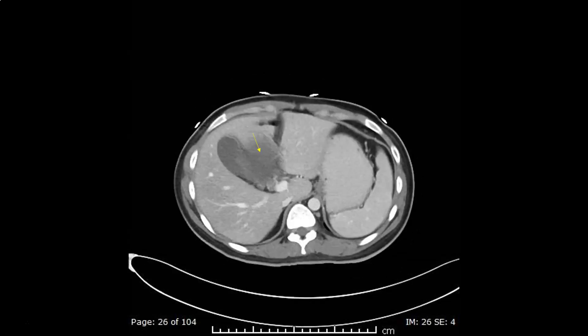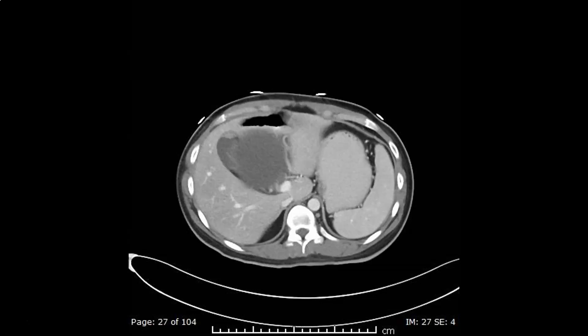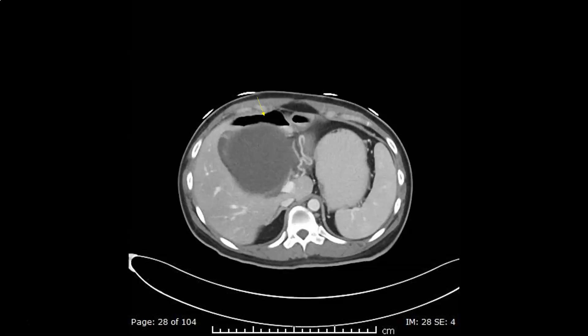The lesion starts immediately under the liver and gallbladder. Both organs are excluded as organs of origin. This places the stomach anteriorly.